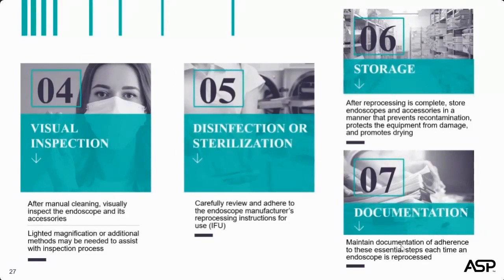There is not a consensus on length of time a flexible endoscope can be stored after high-level disinfection and would be dependent on a risk assessment and the professional guideline the facility decides to follow. It is recommended, however, that the scopes do not touch the floor of the cabinet and that they never be stored in the original shipment case. Always wear gloves when handling clean scopes. Have a method in place for identifying whether the scope has been reprocessed and is safe for patient use. Documentation is essential for quality assurance and patient tracking.